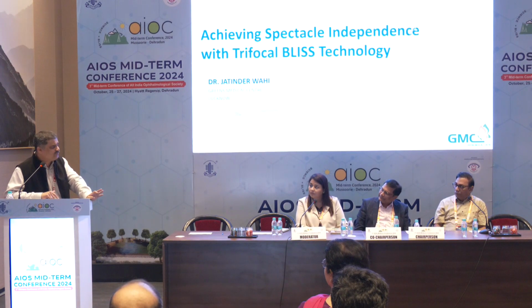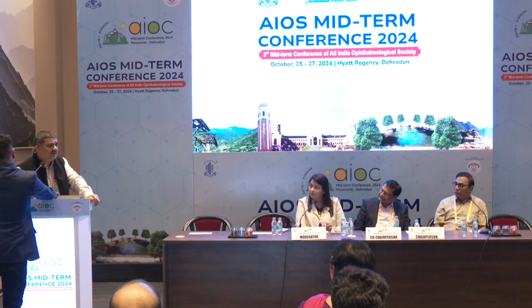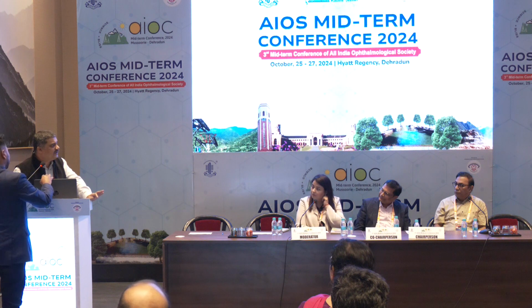In one of my live surgeries, the patient came without dilatation. I used Phenocan Plus on the table. Still the results are the same. That's what I saw Ramurthy doing last time at the Jharkhand Ophthalmic Society. While doing the live surgery, I just used this Phenocan Plus to dilate. But full dilatation is very, very important.